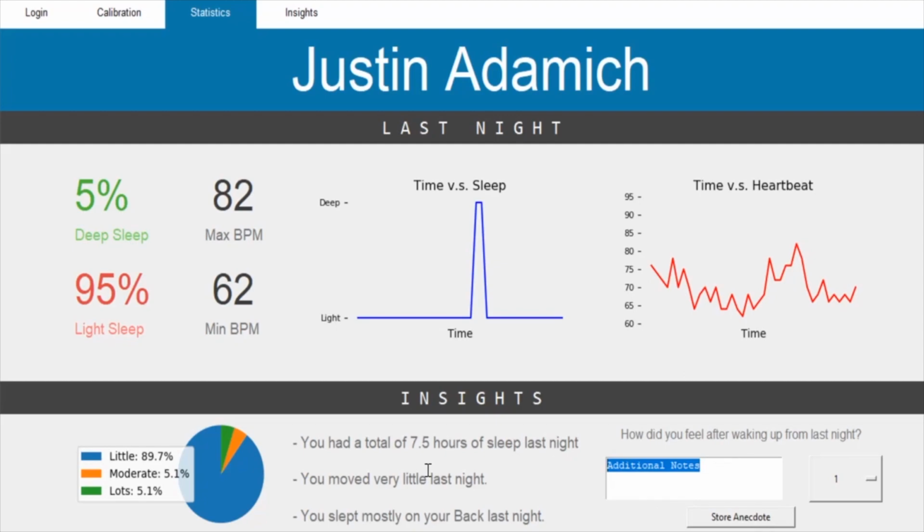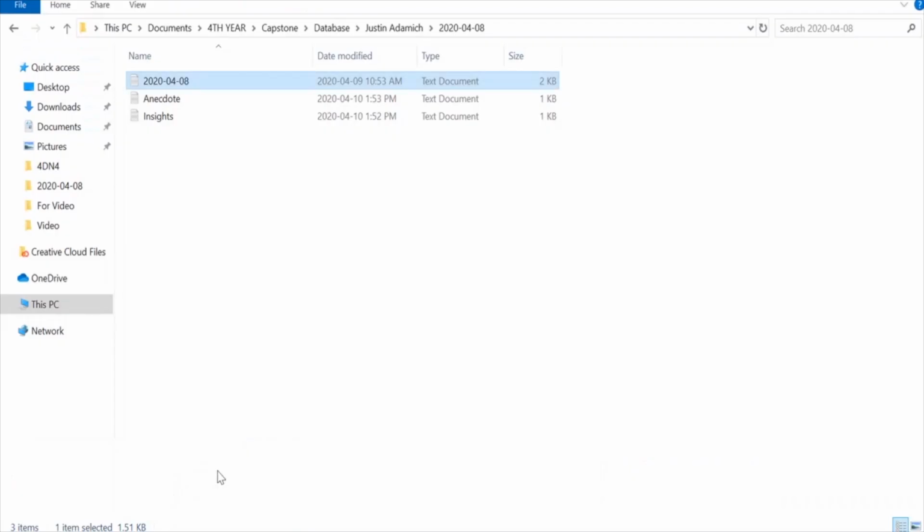Additionally, the user can store a personal anecdote, which we can correlate with some of the data. So they can write, "I felt great when I woke up," and give themselves a score out of 10 and store that anecdote, which you can see is stored here along with the data.